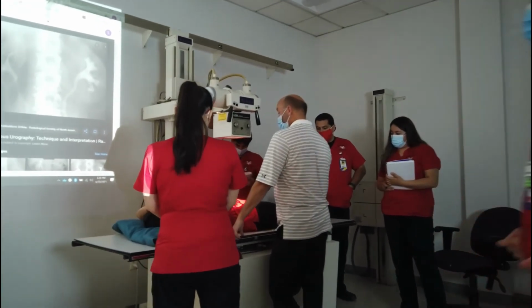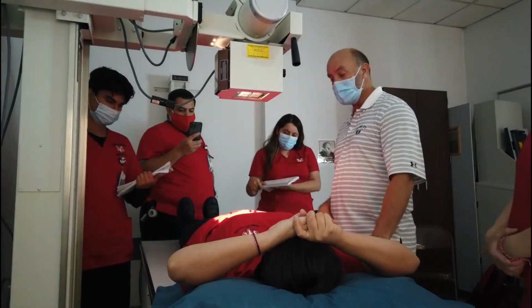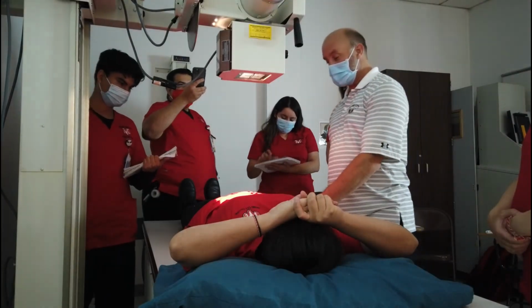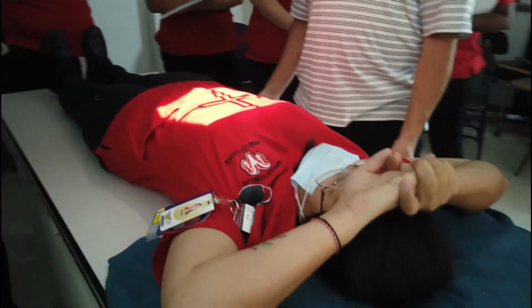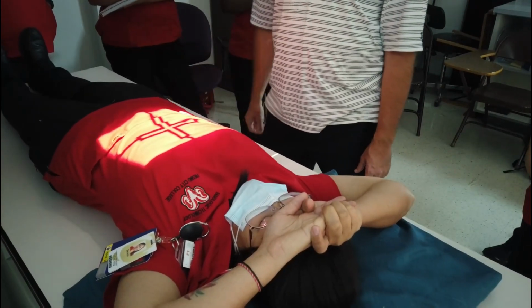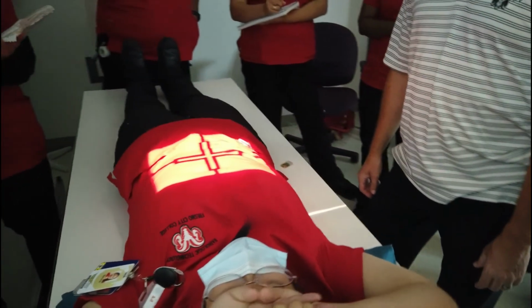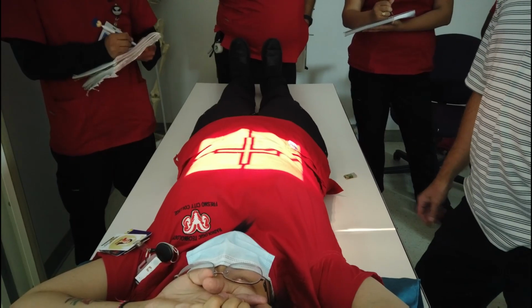The kidneys lie midway between the xiphoid tip and the iliac crest, so you don't have to go and palpate all that stuff. All you have to do is find the top of the crest and put the bottom of the image at the top of the crest, centered on midline. Then you put a right marker in the lower right hand corner, or you can use a left marker in the lower left hand corner. Okay? Simple as that.